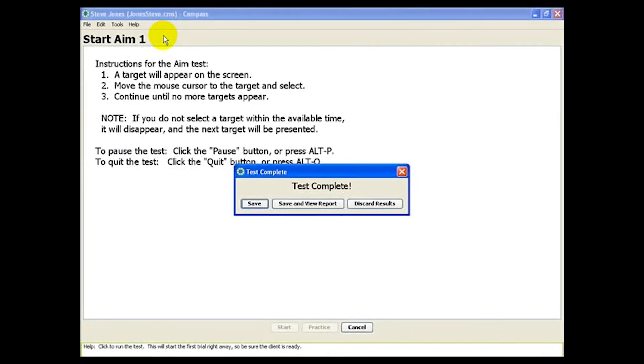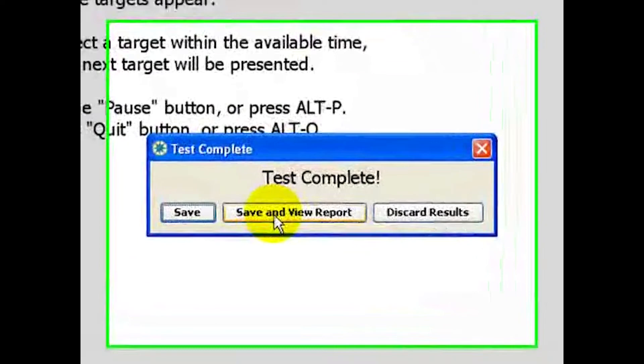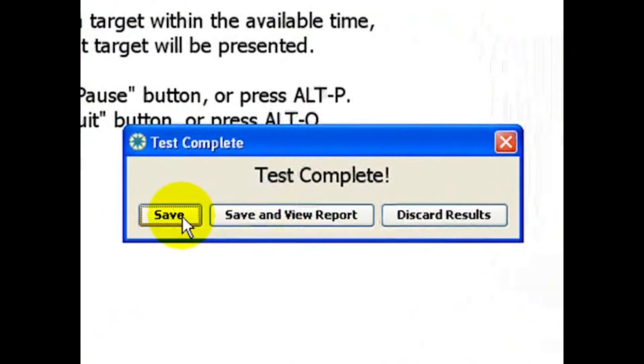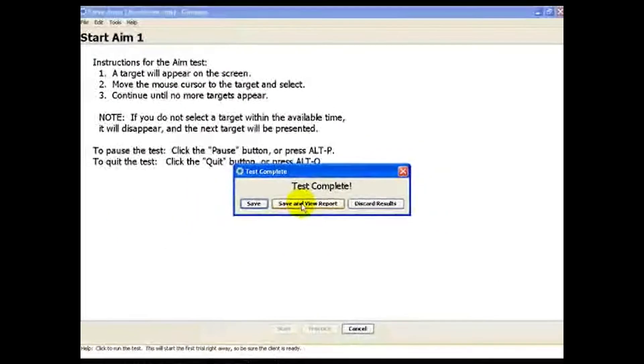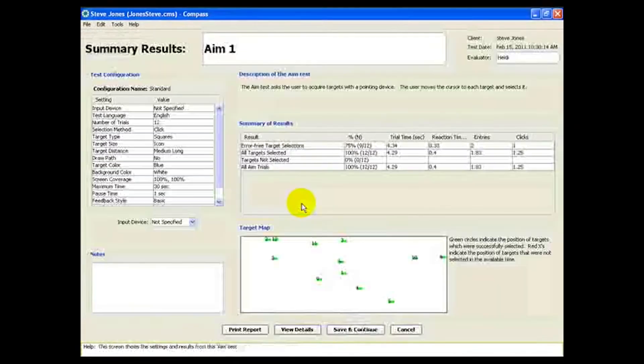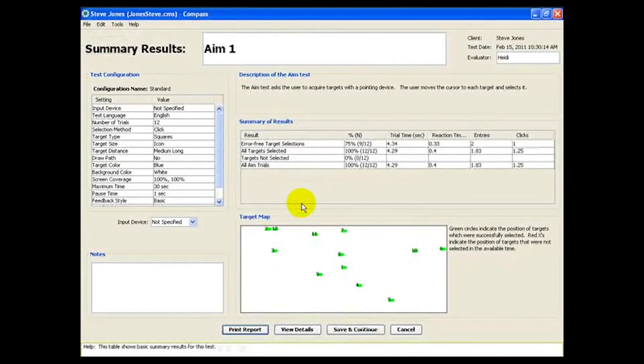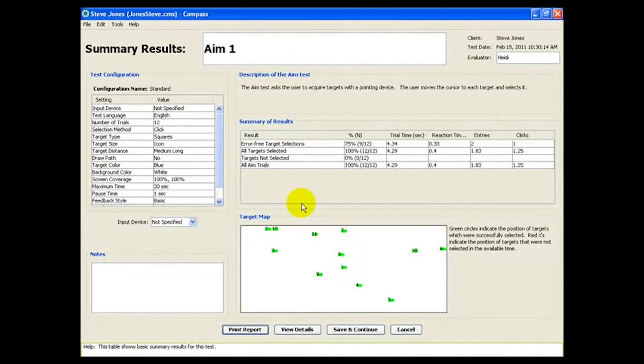At the end of the test, you can choose whether to view the results or just move on. Here, we'll review the report showing the results. This shows a summary of the results from the aim test that Steve just did.